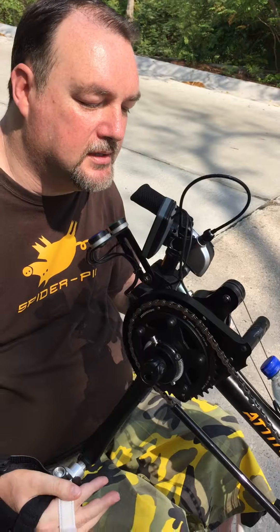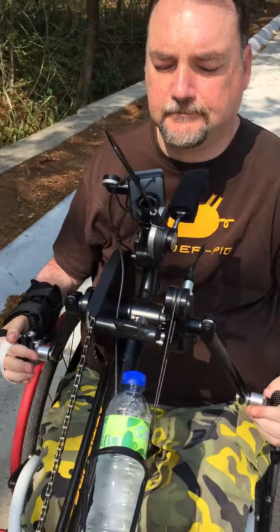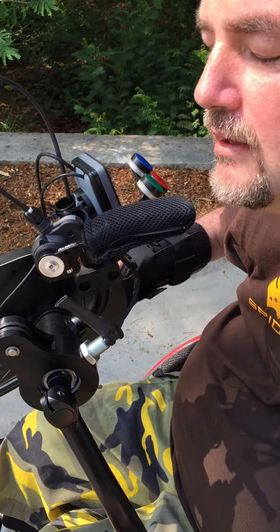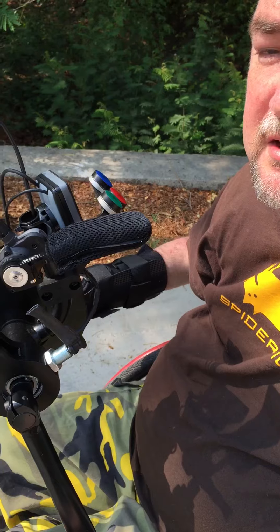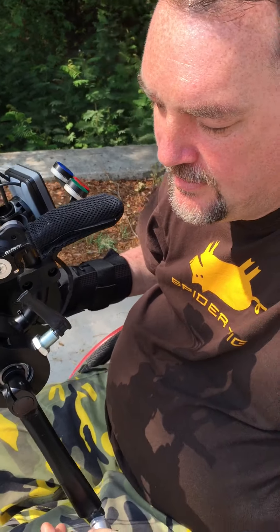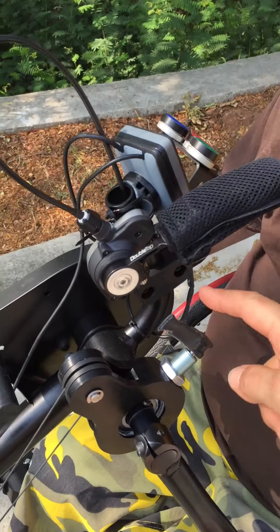If you come around this side you can see the gears. Gear mechanism — dead easy. To go up a gear, one click; down a gear, two clicks. You've got 10 gears in all, and there's a brake here which puts you into freewheel.